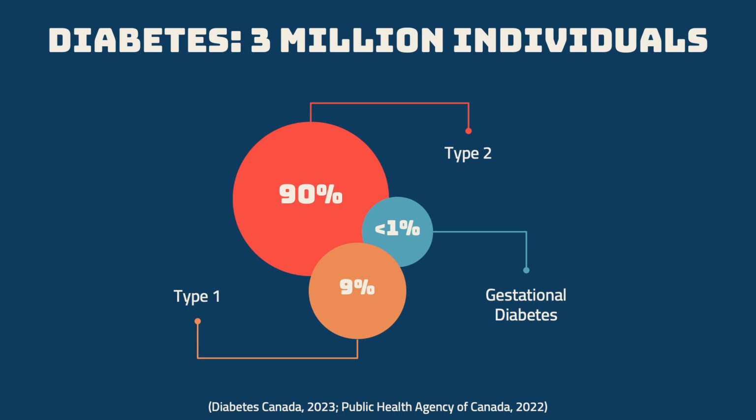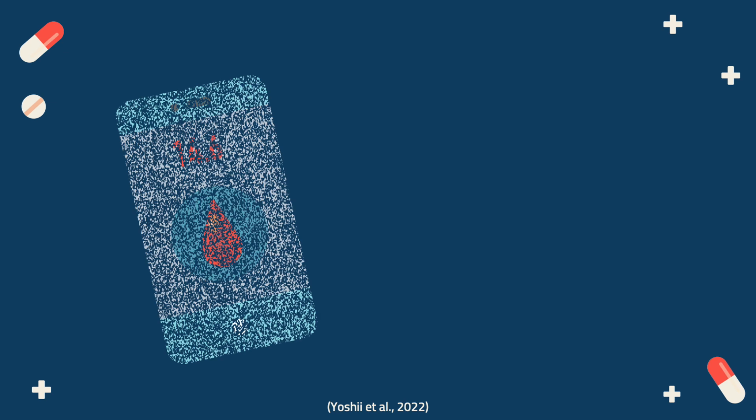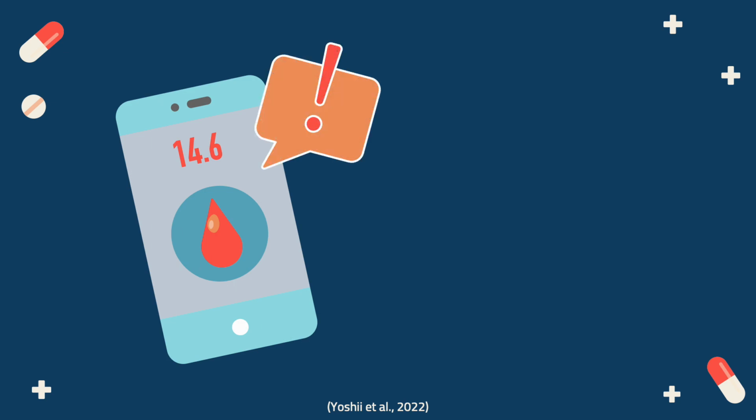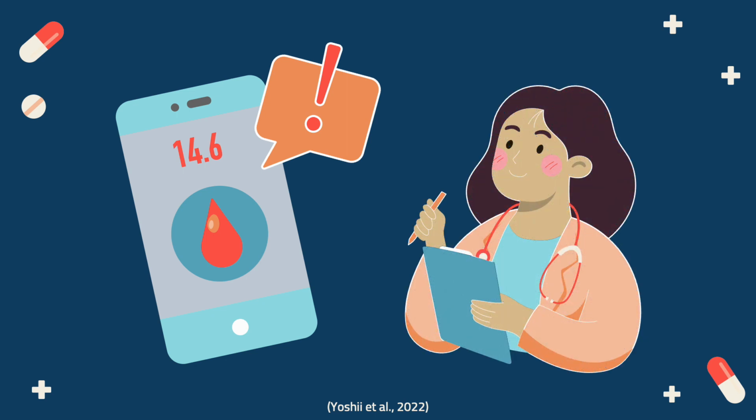The use of continuous glucose monitoring can eliminate the need for finger sticks and manual glucose tracking, it reduces the needed supplies, and it can provide a sense of freedom. Continuous glucose monitoring can alert to highs and lows, allowing the patient to make corrections in the moment and provide this information to their primary care provider. This gives an indicator for the HbA1c results and current management to help reduce diabetes complications.